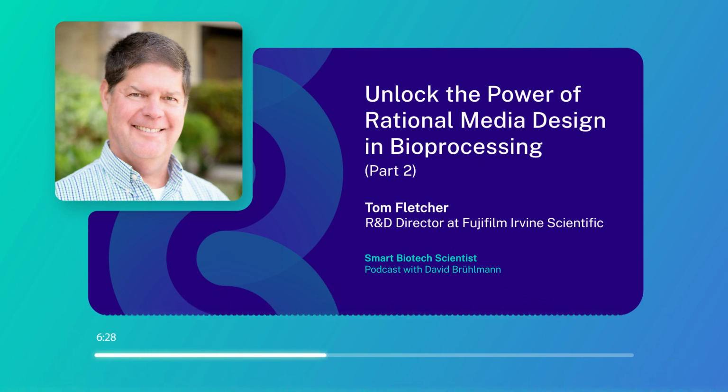And then finally, I guess, using some of the recent systems biology tools like all the different omics, genomics, proteomics, metabolomics, I think these are part of rational methods because now not just choosing all of the tools, but selectively choosing the ones that are relevant to that problem or that question you're trying to answer. I think that's what it means to use rational methods. So that was just kind of a quick summary. I know I'm kind of talking fast, but I just wanted to get a lot in there because it really means, kind of a heads up, eyes open, applying the latest technologies to a focused project where I'm really trying to address a specific issue.